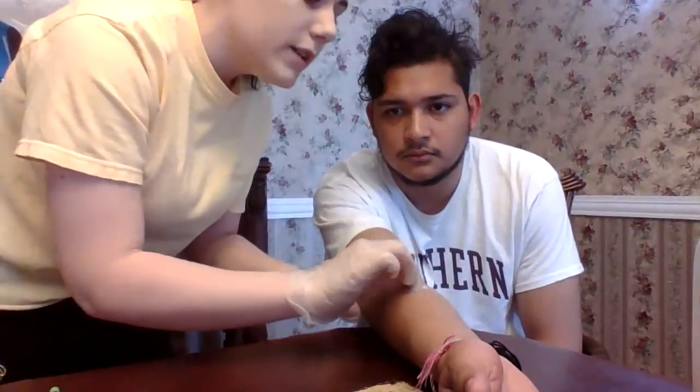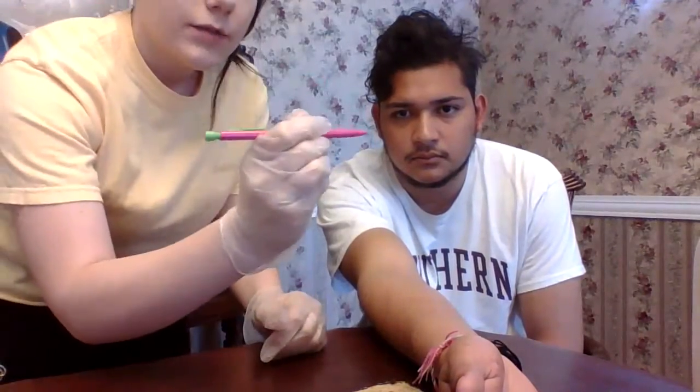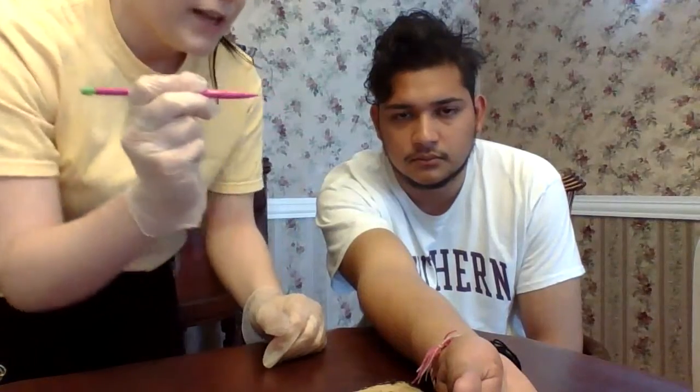The next thing I want to do is go ahead and apply my gloves. I want to cleanse the area with an alcohol swab. So I'm going to cleanse 1 to 2 inches away from the injection site. I want to make sure I give that enough time to dry. So while it's drying, I'm going to take my syringe and needle. I'm going to take the cap off of the needle with my dominant hand. I'm going to hold the syringe like this, like a dart, with my dominant hand. We're going to assume that this has dried.